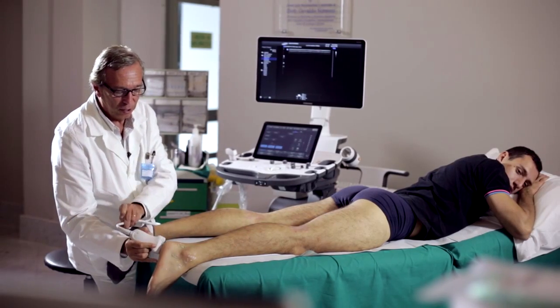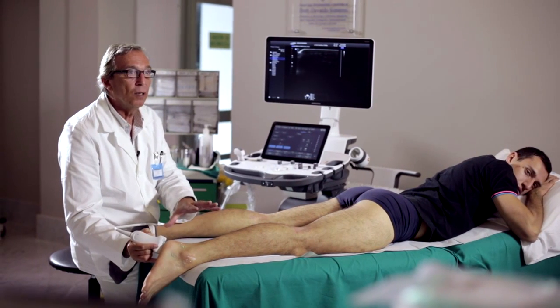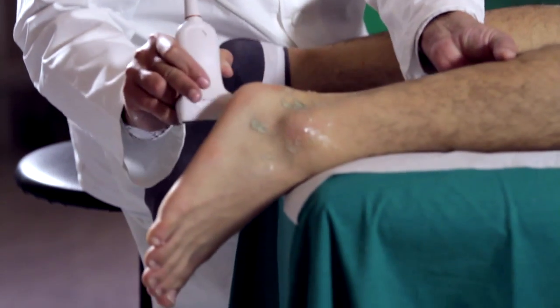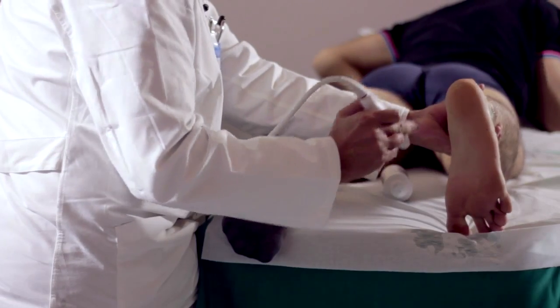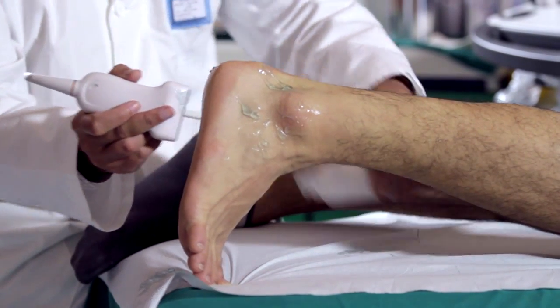Finally, we move to a study which is very important when evaluating the Achilles tendon. This is the study of the plantar fascia, which has an important role as this whole complex works as a functional achilloplantar arch. The main scan is performed in this manner. However, it is important to ask the patient to move upwards slightly in order to place the big toe on the bed. In this manner, we can tense the plantar fascia. This allows us to avoid errors of judgment.